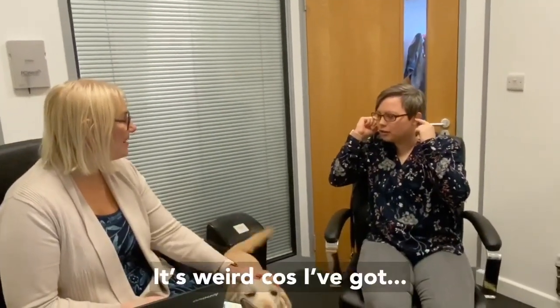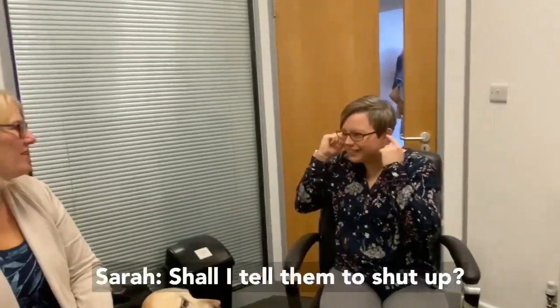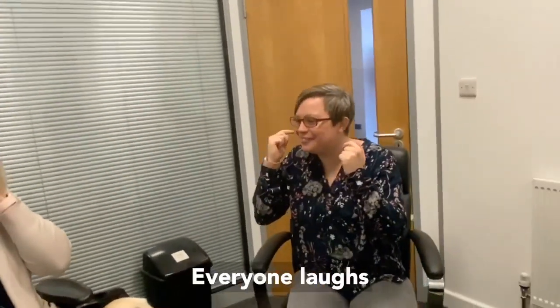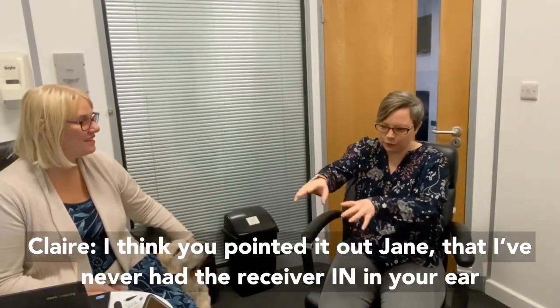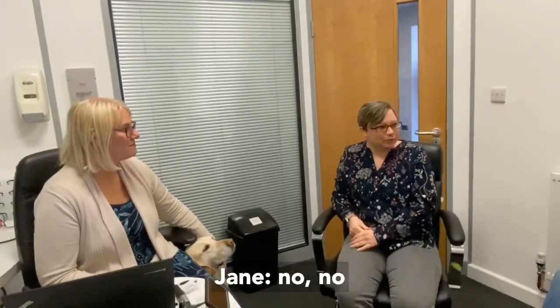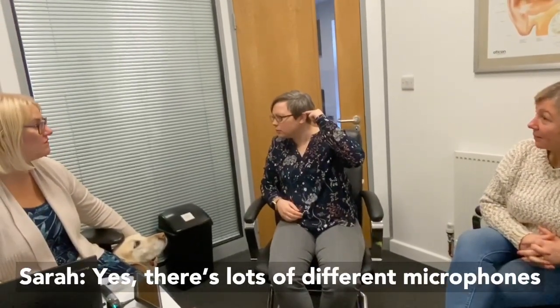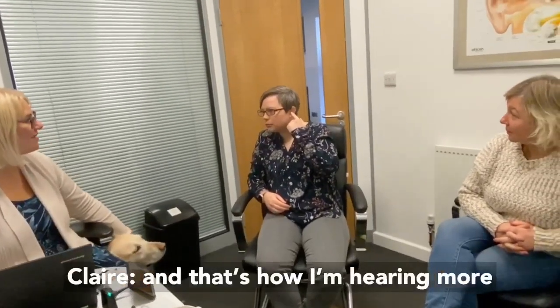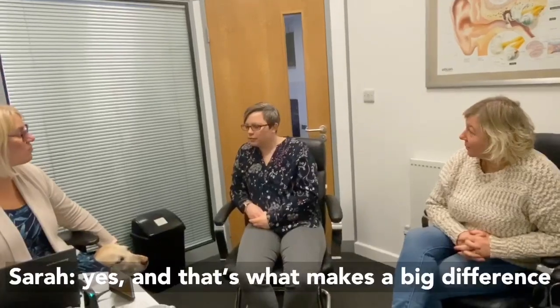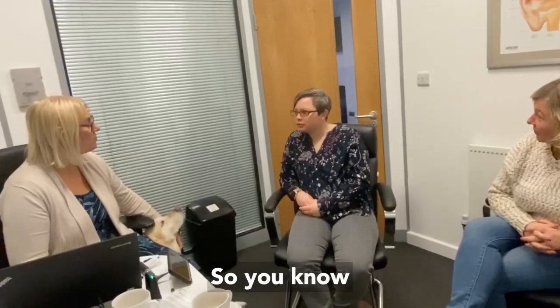It's weird because I've got... You tell them shut up. I couldn't hear them before. That's weird. I think you pointed it out, Jane, that the receiver isn't in your ear. No. Just the receiver's tube, always been on the top. Has this got a top receiver as well? Yeah, it's got lots of different microphones, and then you've got the receiver that goes into the ear, which receives the sound. I'm hearing more. Yeah. And that's what makes a big difference, because the closer you can get to the eardrum, the better the sound.